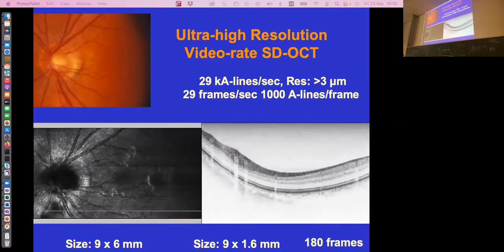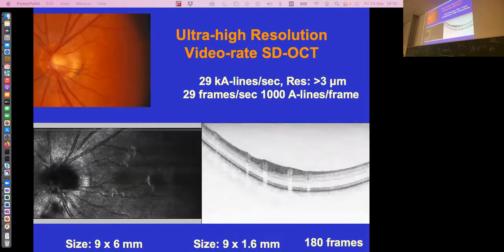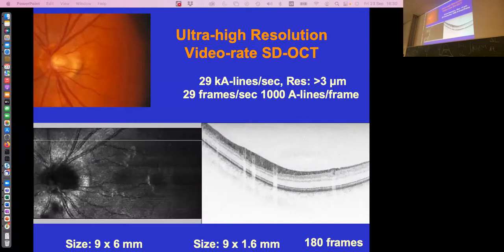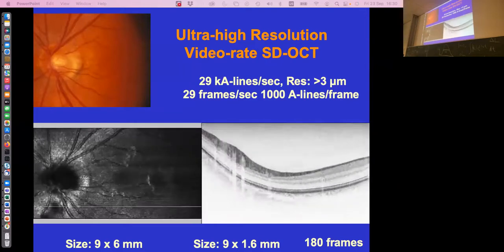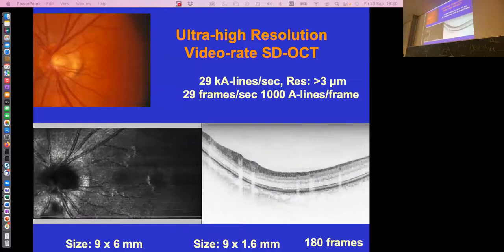It's only 10,000. It's 100 by 100. I recognize you. That's 100 by 100. And the photoreceptor is in the fovea. That's where it's the smallest, about 3 microns. So if you're looking at an area of 300 by 300 microns.